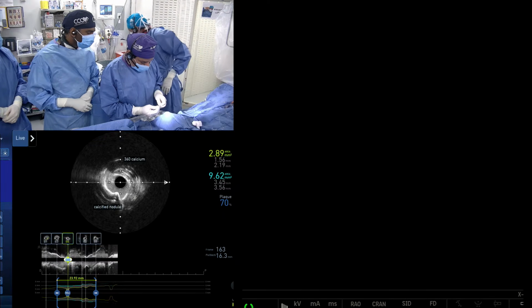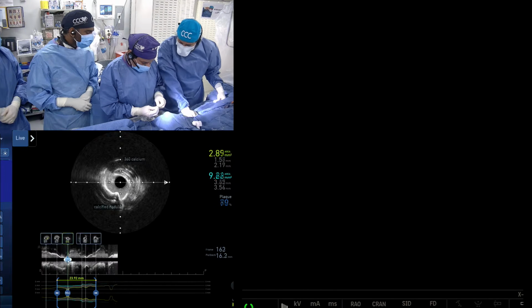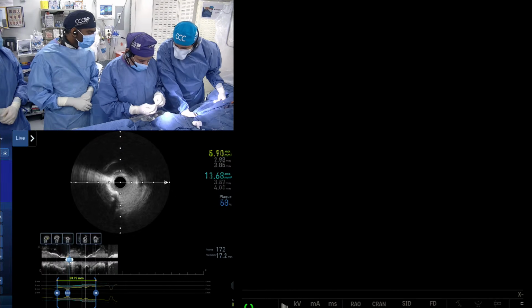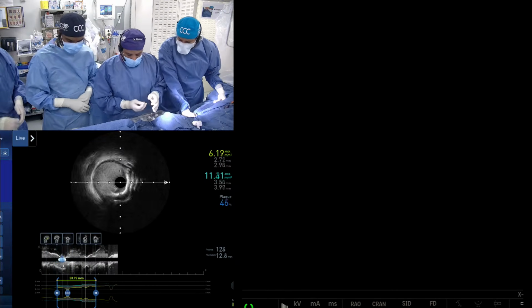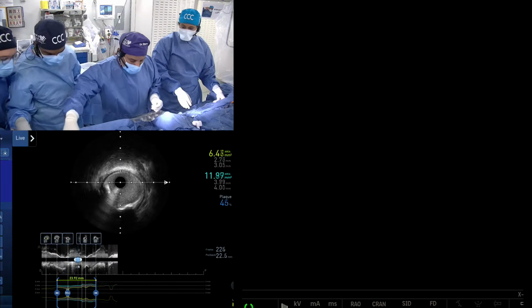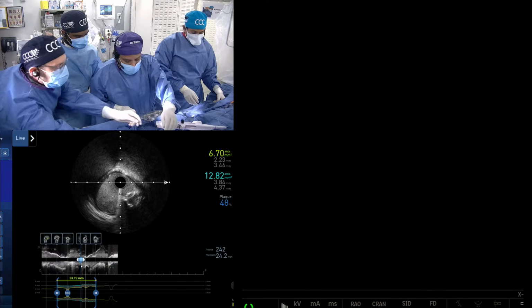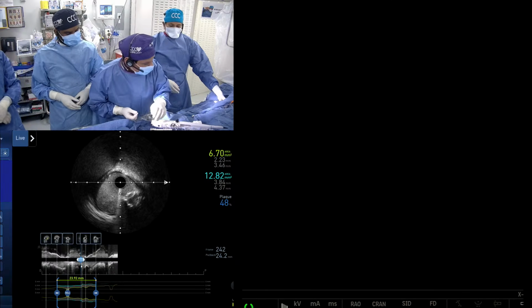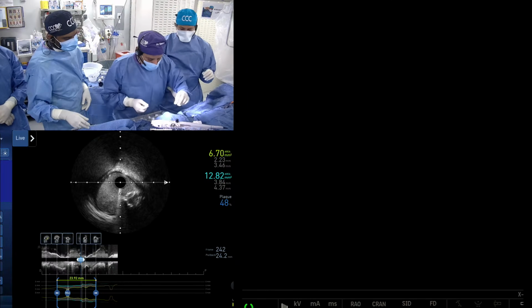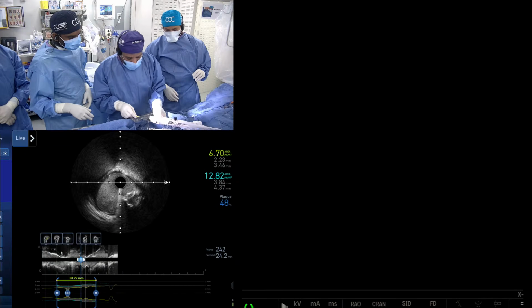Yeah, we saw that here. So what we can do, see, it goes in but does not go any further. So probably something is stuck inside. So what we can do, close the flush now. We have tried all of that. So now get the needle. Where is the needle introducer? Right there. So what you can do, many times you think there is some kink, and so you can put it from the back end.